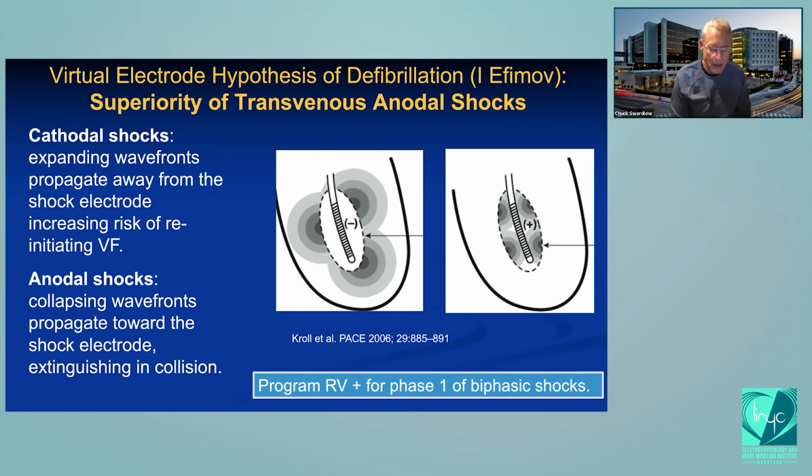This is a misunderstanding of defibrillation data based on some early studies where people claim that altering polarity improved defibrillation. Those conclusions were based on not understanding statistics correctly. And if anyone is interested, I can pull some slides to show you that.